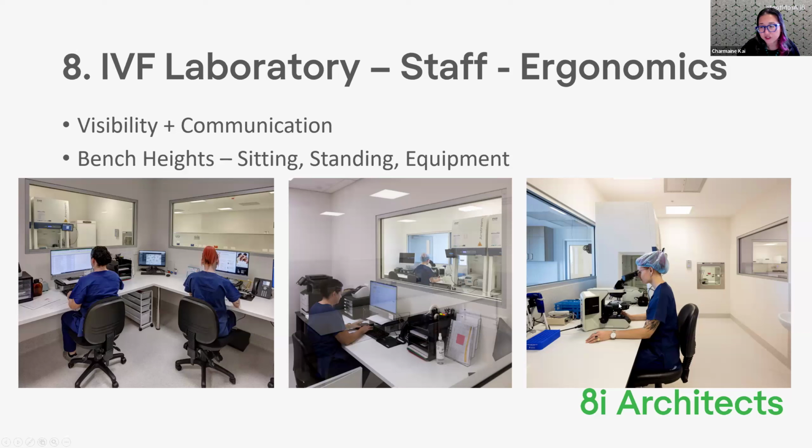And then in the case of, say, the andrology lab on the right here, we've got an airlock, a little hatch that goes into the embryology lab. So things like that save people time, in that they don't have to carry sperm into the embryology lab, they can actually just pass it through the wall. So we use a lot of pass-throughs within the labs, and also maintain pressure within the lab space. And then we'll have a little intercom to talk between the labs. So there's a little intercom there next to the hatch.